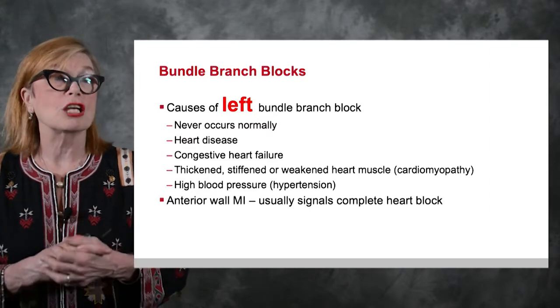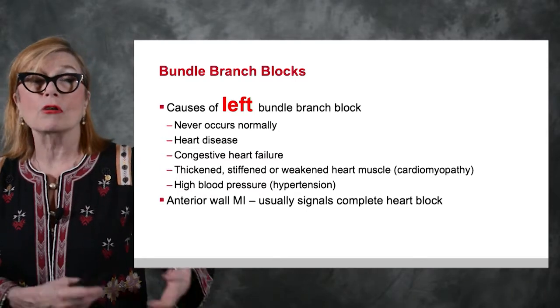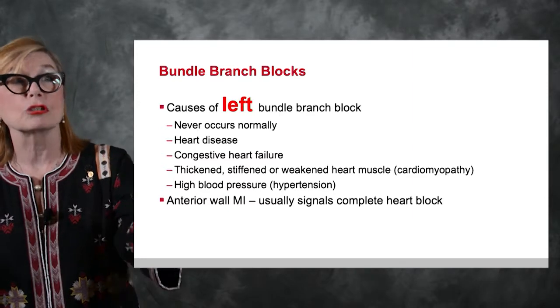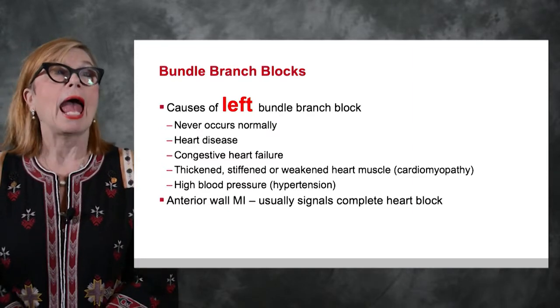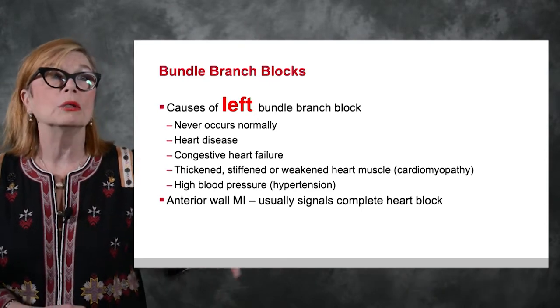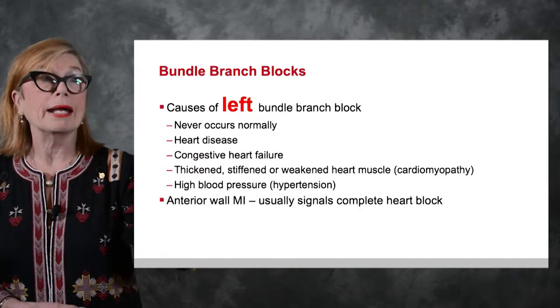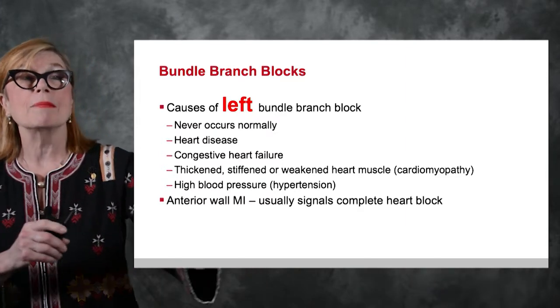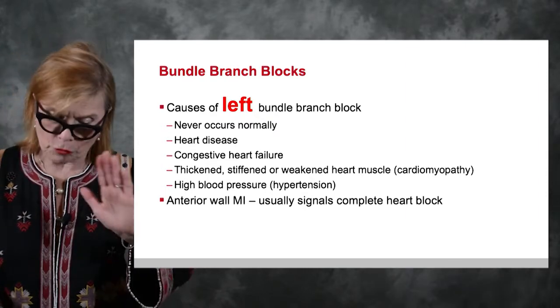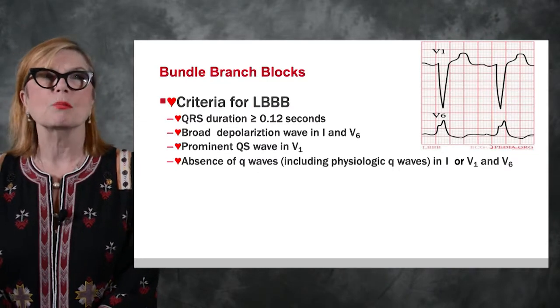We are going to appreciate that it's subtle to look at a left bundle branch block. In the side of the heart where you have the bundle branch that is not functional, current is going slowly, slowly to that side, and when you repolarize, you will have an inverted T wave only on the left side of the heart. So in left bundle branch block, we'll have an upright R. It will take more time than 0.12, and the T wave will be inverted. Those are simple rules of thumb that help us when we look at left bundle branch block.